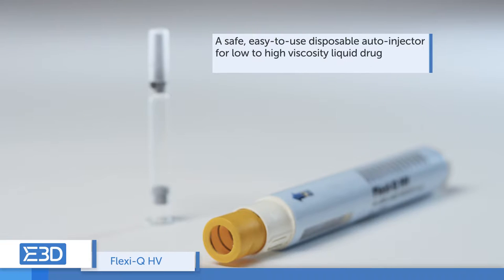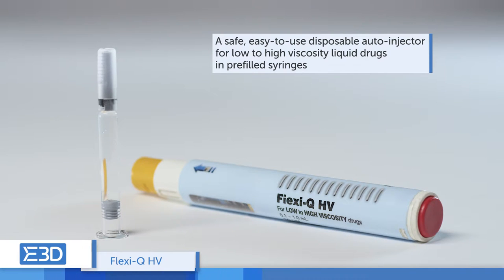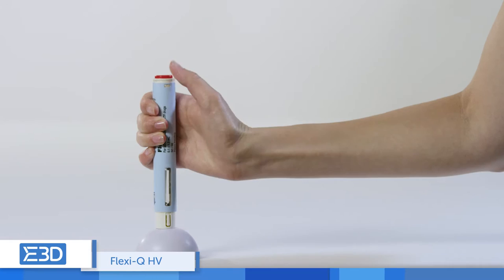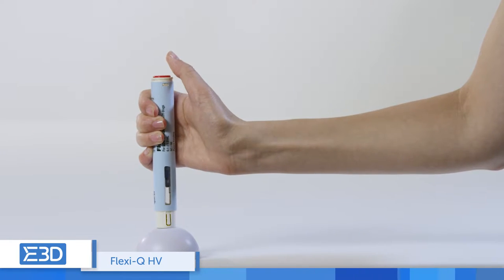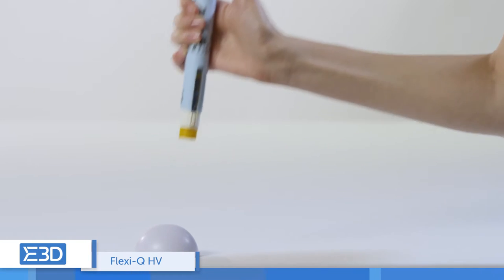The FlexiQ-HV is a safe, easy-to-use, disposable auto-injector for low-to-high viscosity liquid drugs in pre-filled syringes. This device features a fully automatic injection process and enables injection of 150 centipoise drugs in less than 10 seconds with a standard needle.